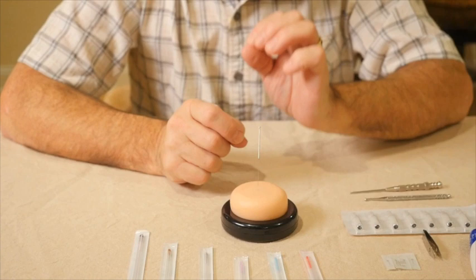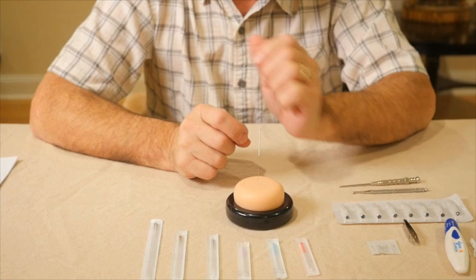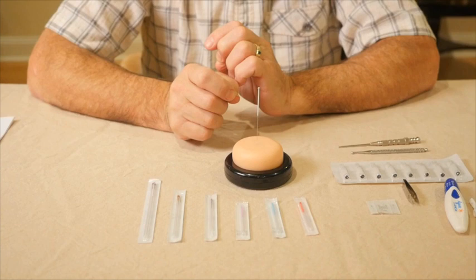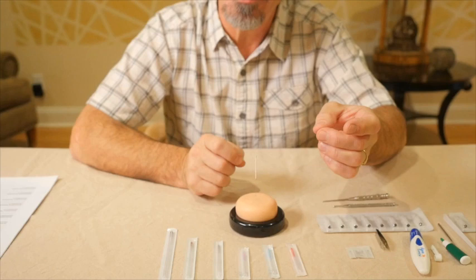A needle that's particularly thin — if it's too thin to be easily managed — may be more painful for your patient. So in many cases, a heavier needle can actually be less painful. It's something you need to experiment with as you practice. The more you practice and the better your needling technique becomes, you can move on to thinner needles. But in the beginning, a slightly heavier needle is best — a number 3 or number 5 is a good place to start.